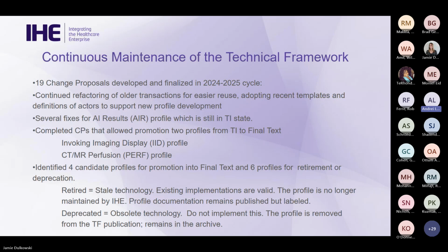So we will not maintain that profile any longer. We will not implement any change proposals for those profiles, but they could be found in the published documentation, and they will be labeled as retired. We deprecate the profiles which use obsolete technology, or there is really no use case, they've never been implemented, and our recommendation is do not implement these profiles. Don't even look at them.